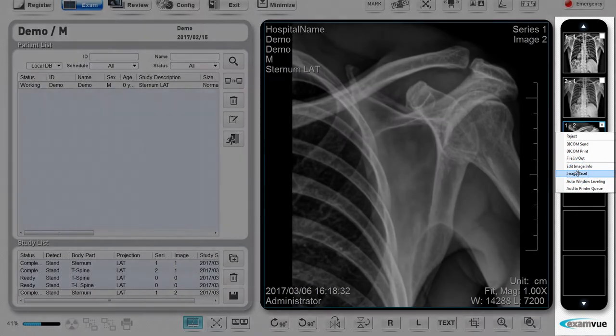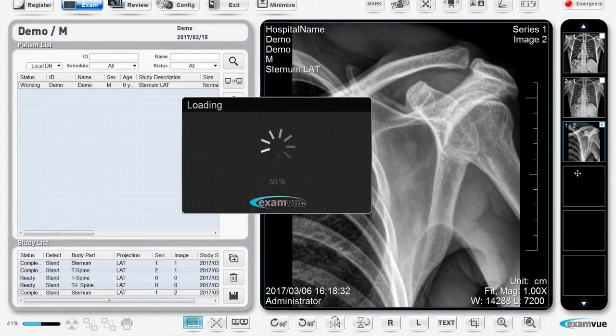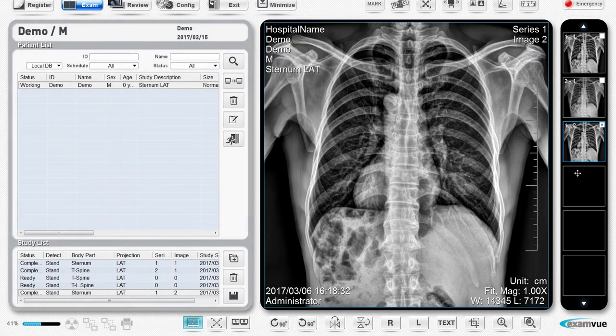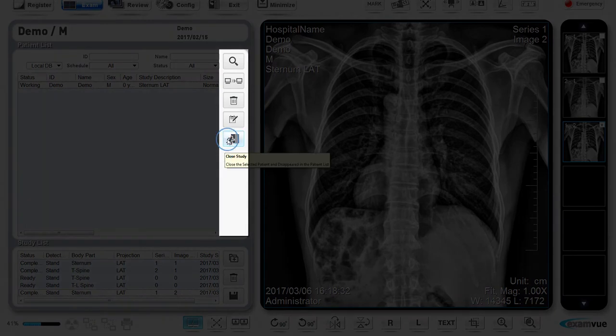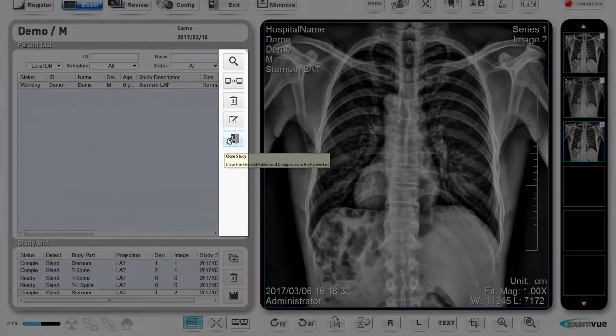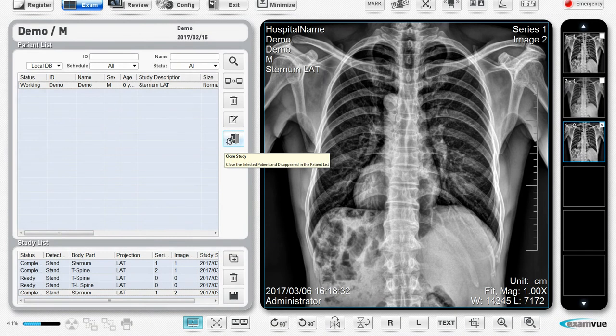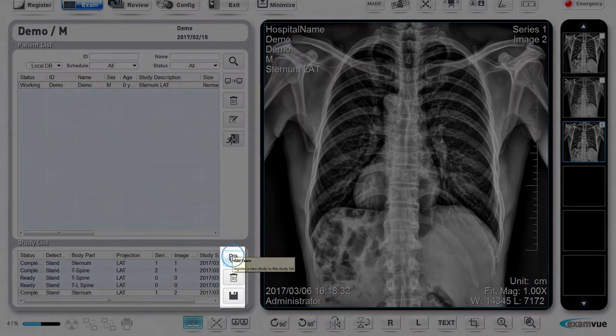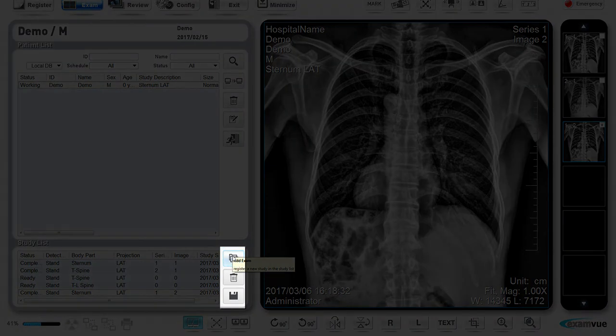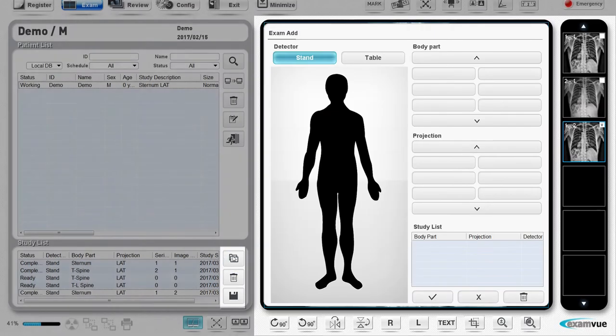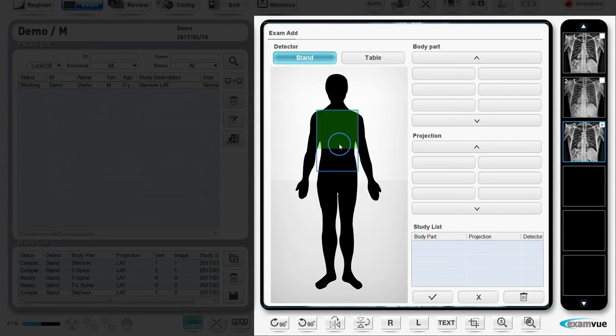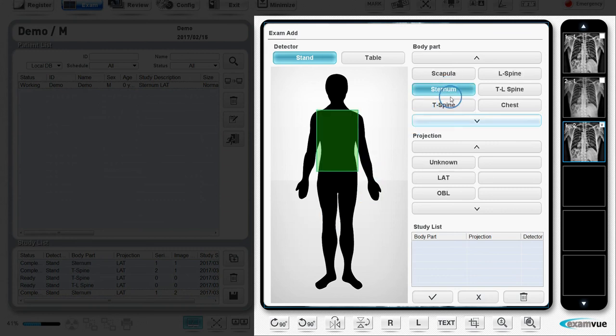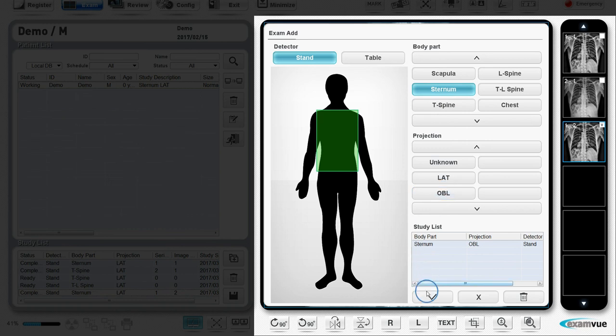When you're all done with the image and the study, you can close the study by clicking the close study button. If you finish the study and realize you need to add a view you did not expect to add, simply click on the exam button. This will bring you back to the registration window where you can select the body part and view to add to the current exam. Now you're ready to take the x-ray again.